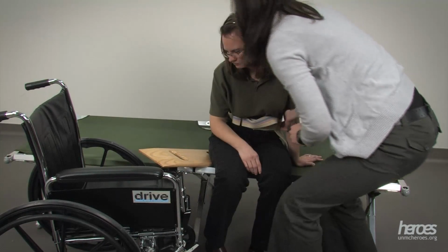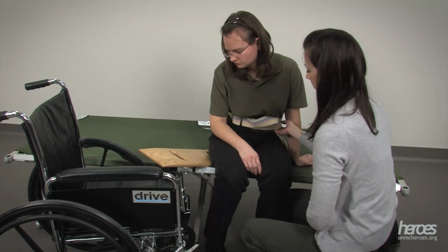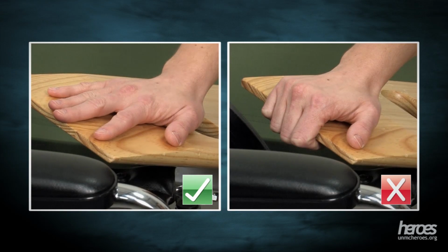Ask the individual to place their hand that is closest to the wheelchair onto the far side of the slide board. Make sure they do not curl their fingers around the slide board because the fingers can get injured during the move from the cot to the wheelchair.